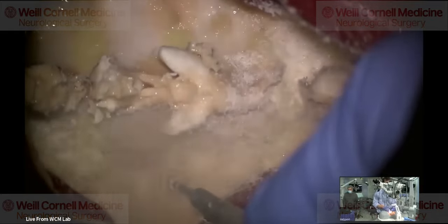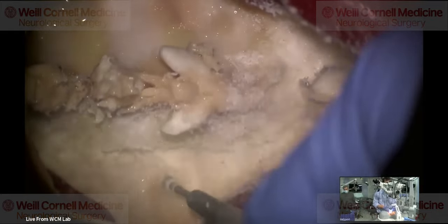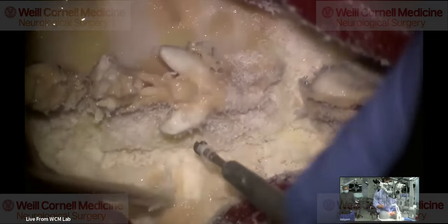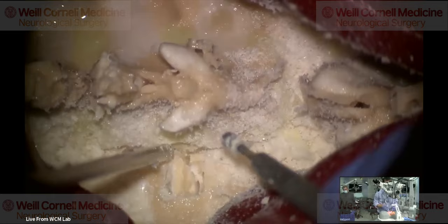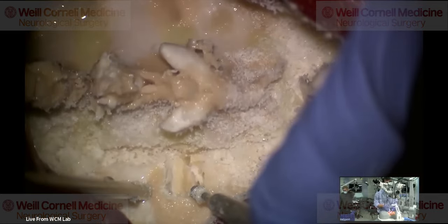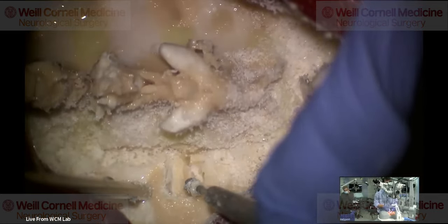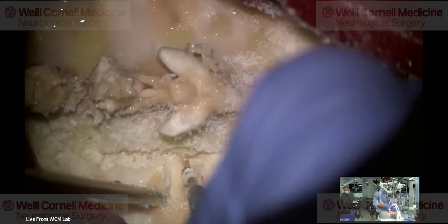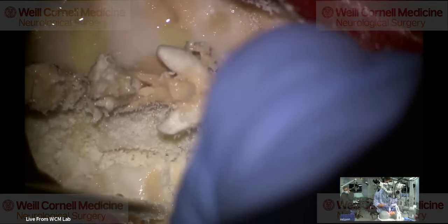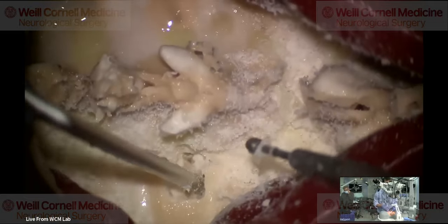One other thing is I use what's called bivector traction, where I have one traction rope on a Jackson frame that would pull the neck into flexion, another one that would pull it into extension. So I start with the patient in flexion. Here you can see the leading edge of the superior articular facet, right down there.